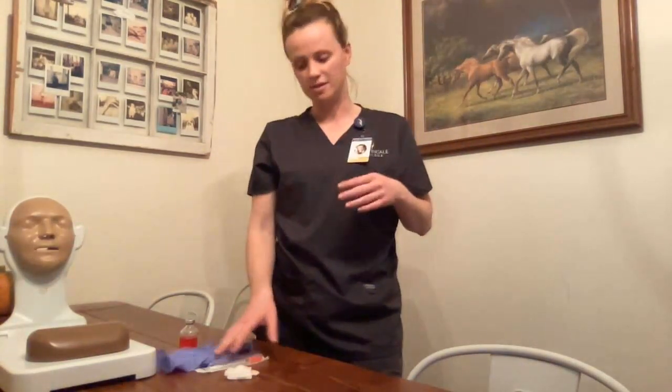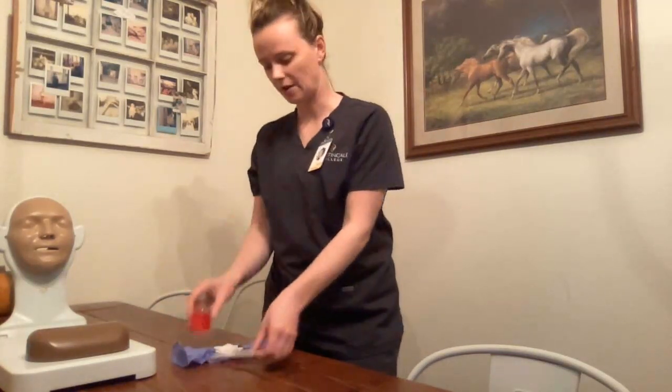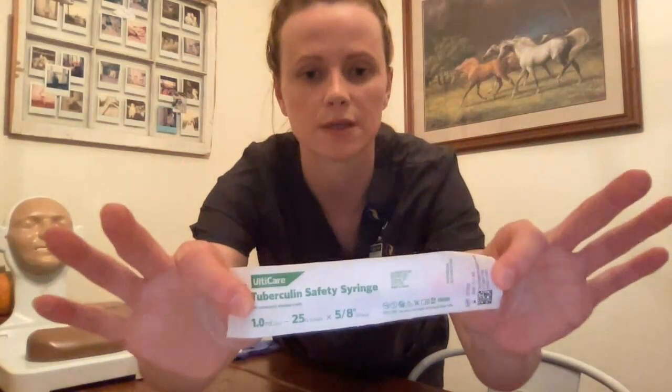To start the skill off, I will gather my supplies for the video: a pair of gloves, gauze, two alcohol wipes, medication vial, and then the needle and syringe needed for this skill video is a 29 or 30 gauge half-inch needle, one milliliter syringe — but due to the supplies we were given, this is what I will be using.